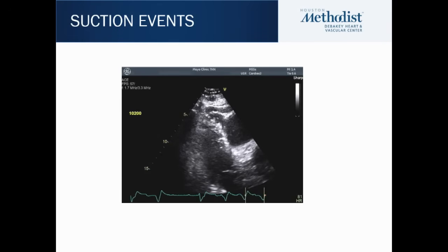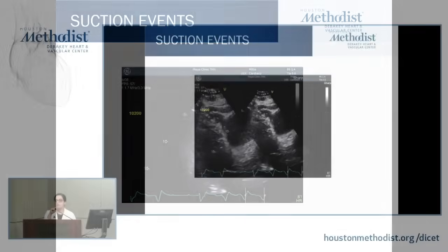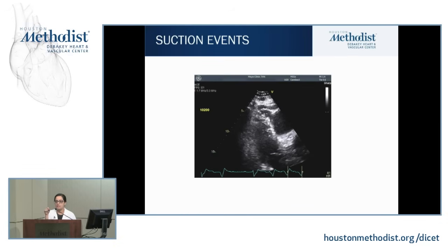So again, in these patients, you may not see suction when they're lying flat. So you have to make them do things that can reenact what exactly is happening. So this patient told me that when he shifts his position from back to side, that's when this happens. So I made him do Valsalva at the bedside, and I made him do exactly the same thing that he was doing. And sure enough, with that change in position, he had a full run of VT. He was about to get shocked, and then we knew that was the problem.